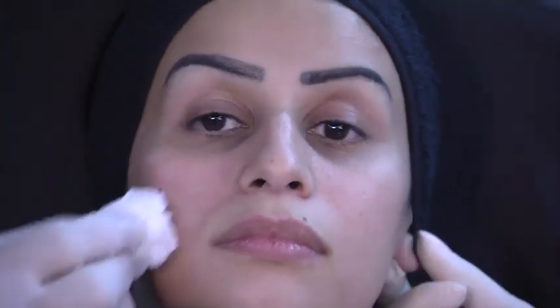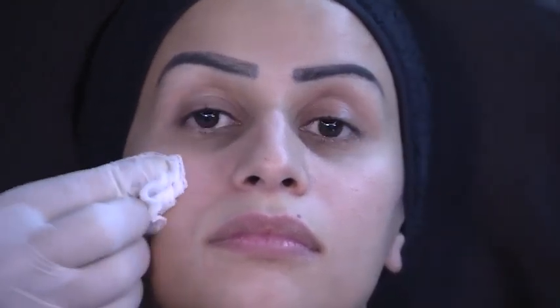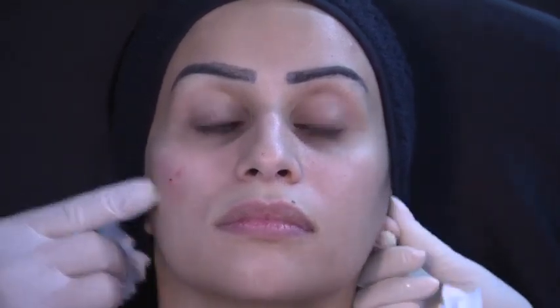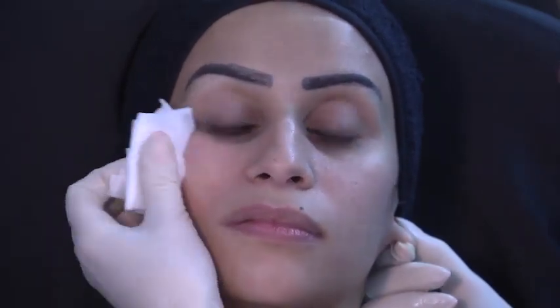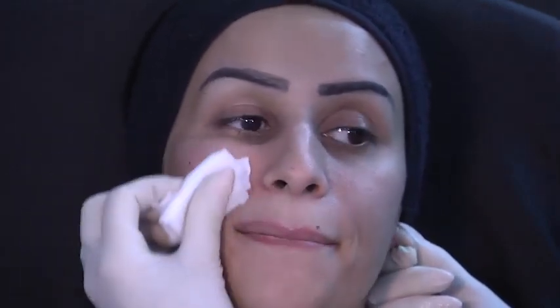Wait, I want to show you how a little bit exaggerated the nodule. So instead of looking at the syringe, you just have to look at the skin of your patient. Okay? Look how we are lifting all this tissue and we are creating this shadow that many women want to have with makeup. They do make up this area with a little shadow to highlight the cheekbone. So we can have this as a natural thing. So your main goal here is to define the cheekbone rather? Exactly. We are contouring, we are creating an elegant high cheekbone. We will see when I finish the final result.